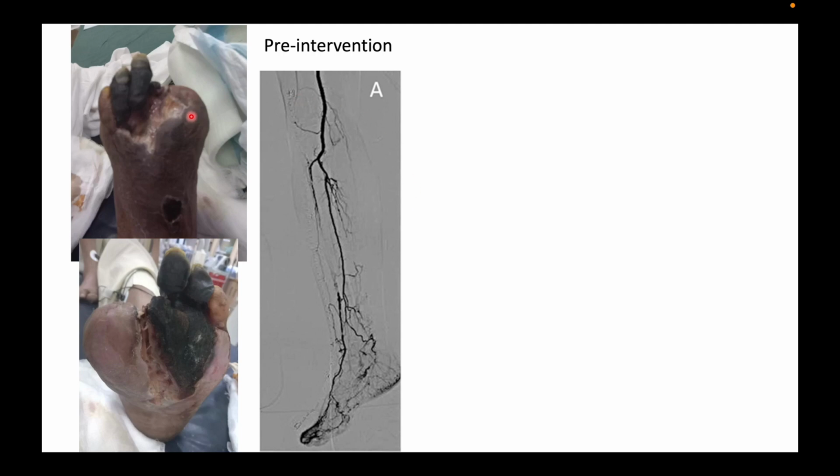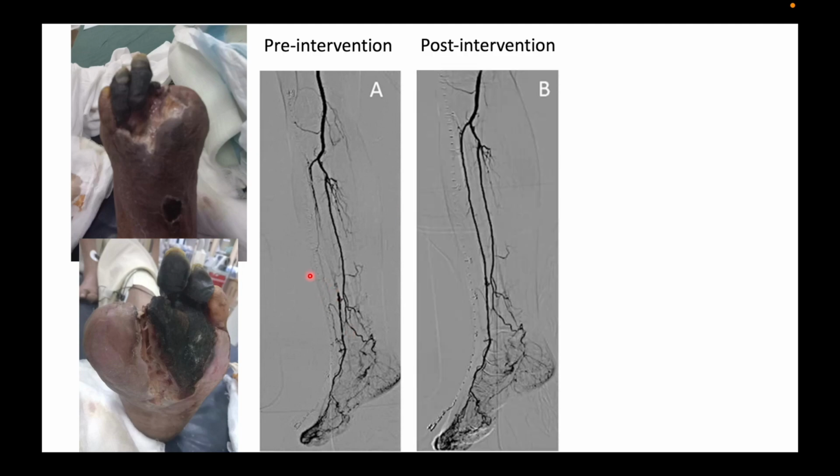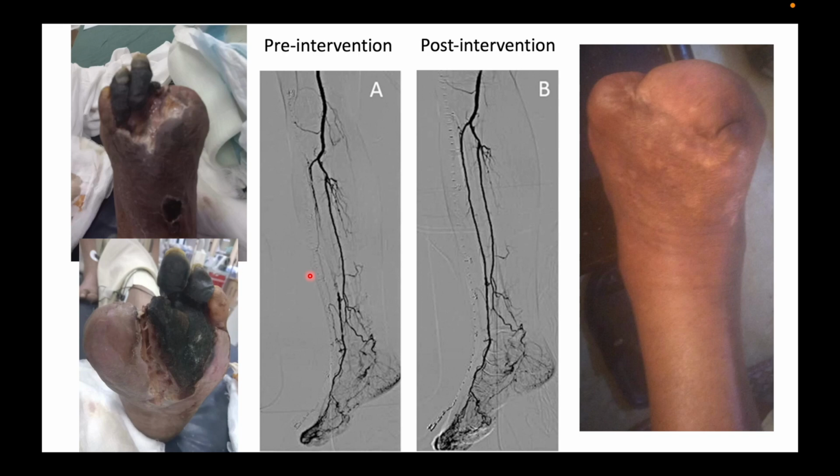Look at the condition of the foot here, how bad the foot is. Look at the gangrenous part and all, and how the pre-intervention picture looks. This is post-intervention. This is just balloon angioplasty, and look at the foot healing after a few months.